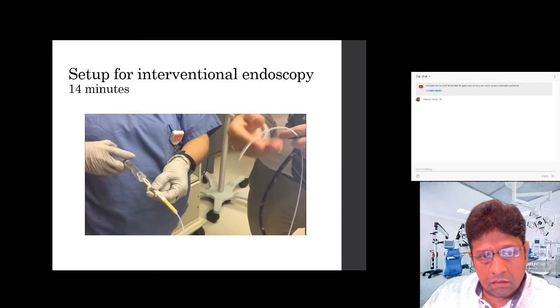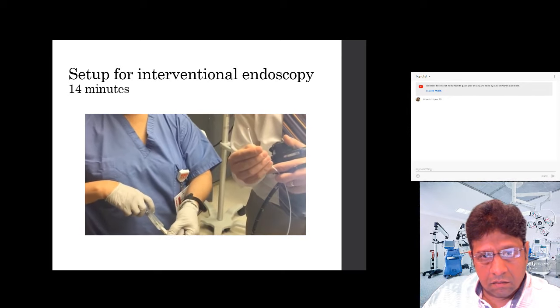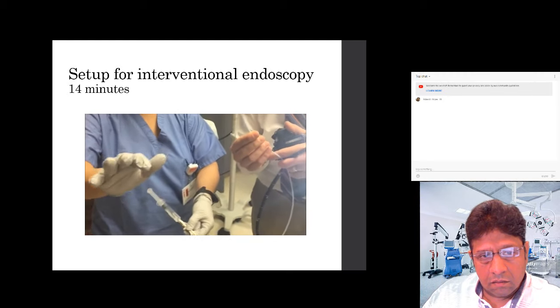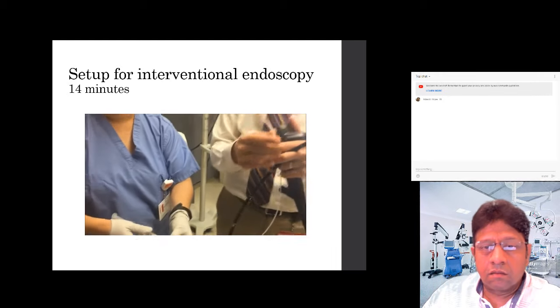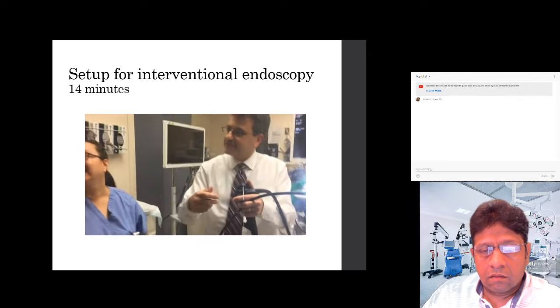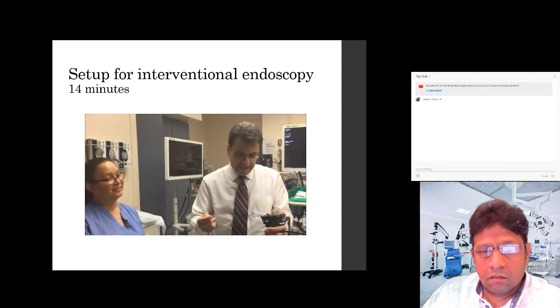We do priming it first. But once the needle's out, we probably squirt you. Sorry. But anyway, so that's how you inject the epinephrine, right? So you put the needle out, and then you inject it. And again, it's all the same.